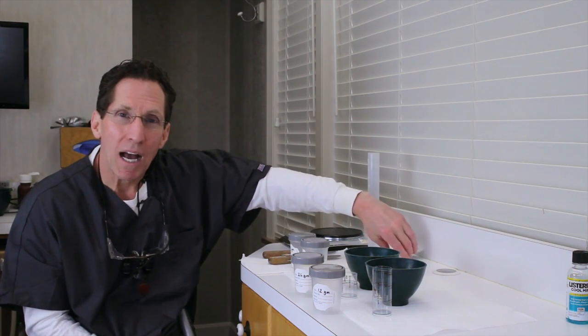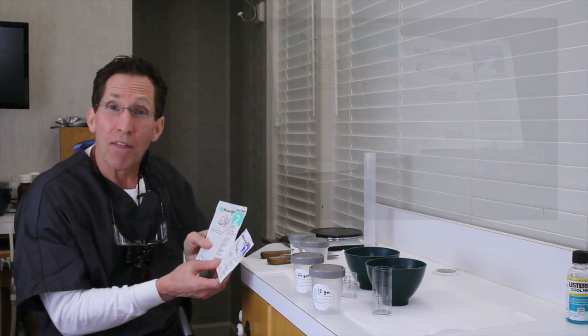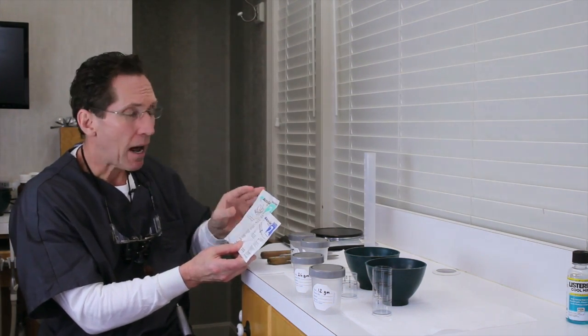Now, that idea really came about as a result of using 2 viscosities from Ivoclar Vivadent, and you can still get these. If you would rather use these materials than the Gel-Trate regular set, it's their System 2, which has a low viscosity and a high viscosity mixture. That's really where the idea came from. And those are about $3.50 a piece. And it's a wonderful material.